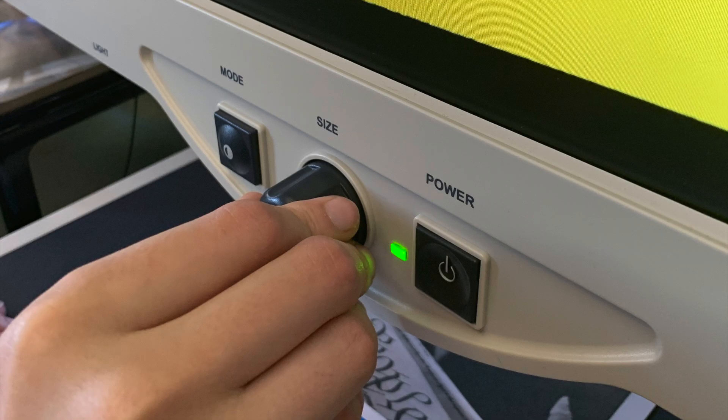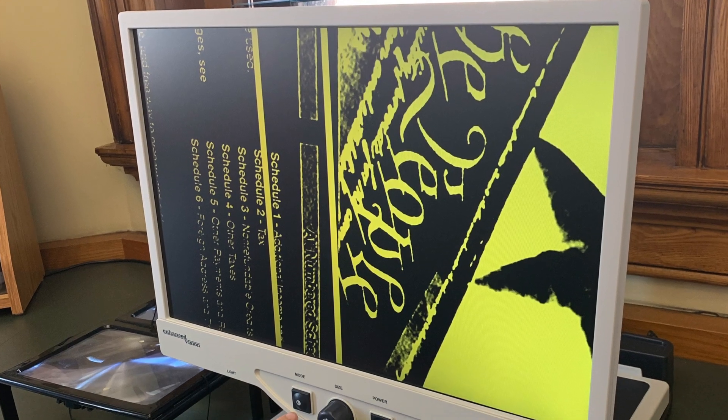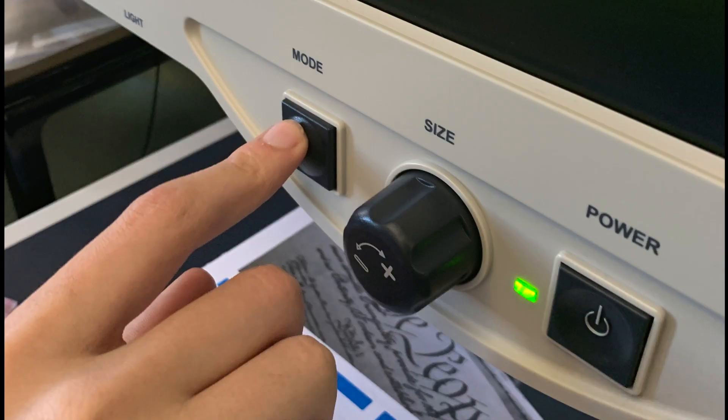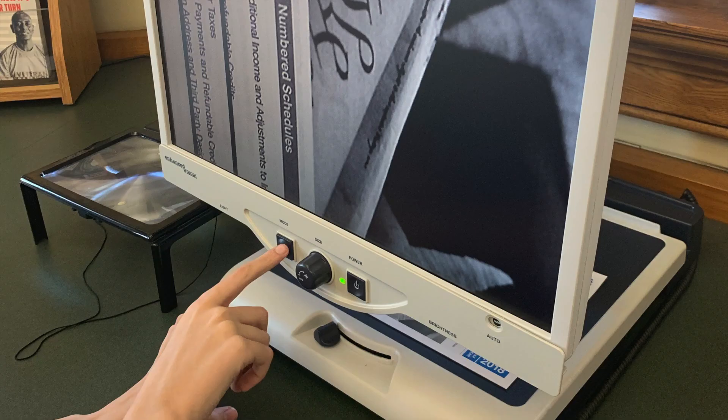If you'd like to adjust the level of magnification up or down, you can use the dial labeled size. To change the colors and saturation on the screen, you can toggle through the presets by pressing the mode button until you've found the preset that works the best. They have black and white, high saturation, and various color combinations, just to name a few.